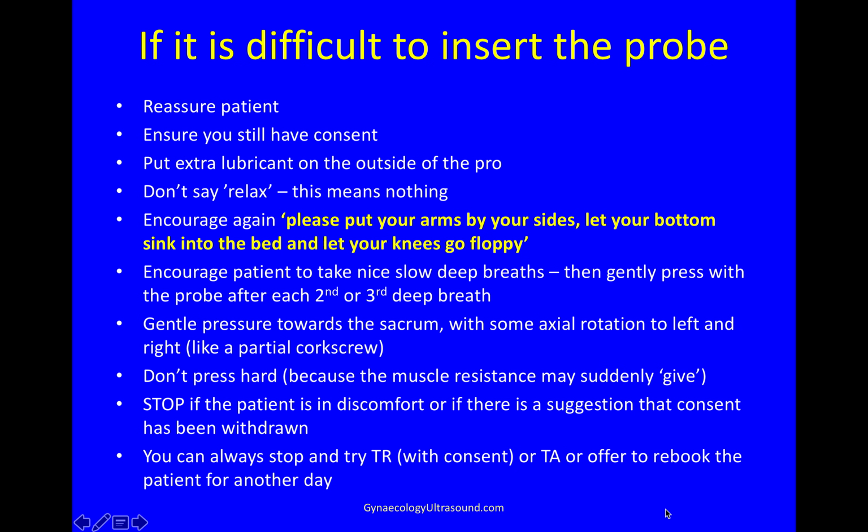You can always stop and try a transrectal scan if the patient is happy with that, or transabdominal, or offer to rebook the patient for another day or with another clinician.